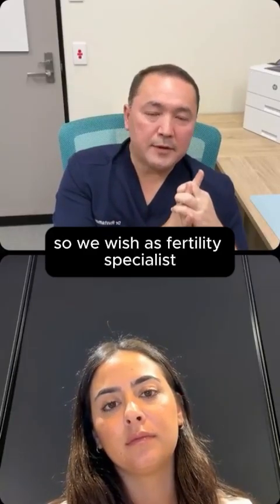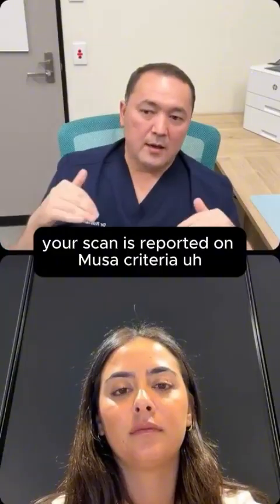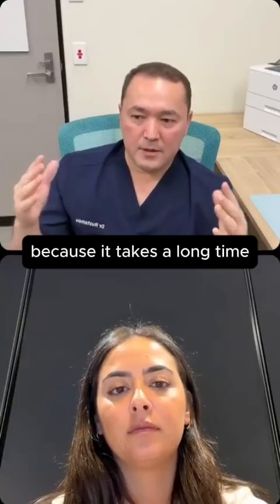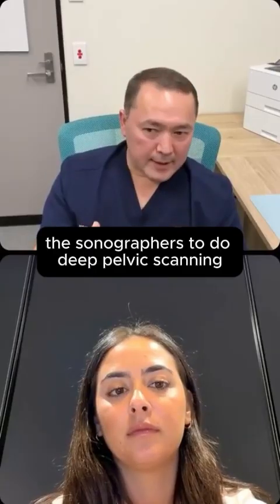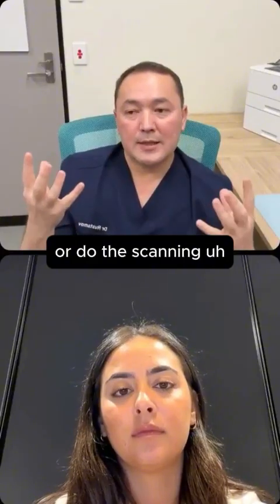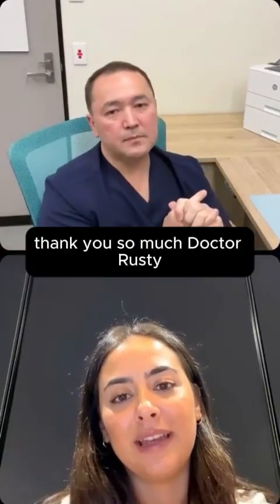So we wish, as fertility specialists, that every time you have a scan, your scan is reported on MUSA criteria, which doesn't happen often because it takes a long time. It's a very thorough scanning. But in patients where we suspect uterine pathology, we normally request the sonographers to do deep pelvic scanning, or do the scanning using MUSA criteria for diagnosis and reporting of uterine pathology.